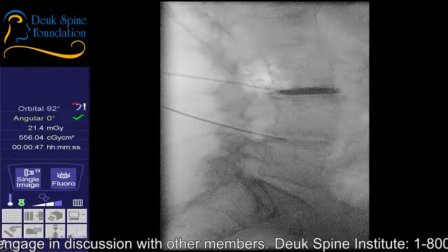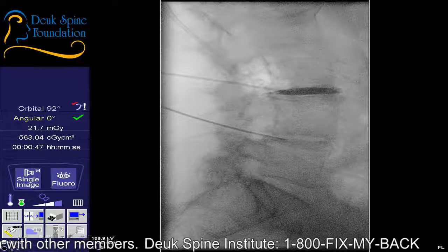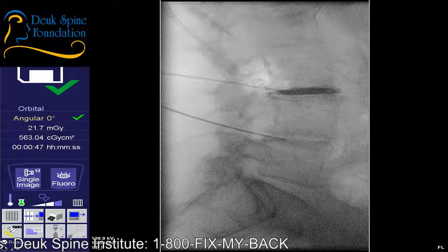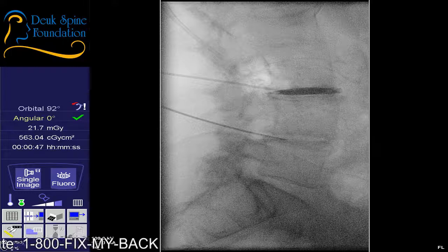Did that hurt? How bad on a scale of 1 to 10? A 10. Is that the place where you typically get back pain? Yeah? All right, so we have concordant pain, 10 out of 10 at L3-4, which is good. It's a really good sign.